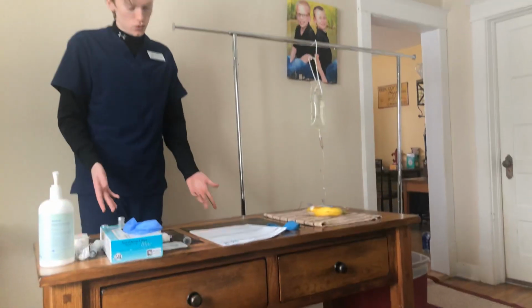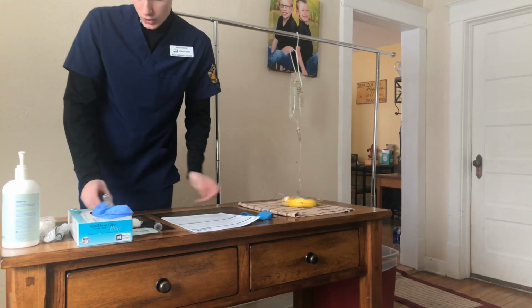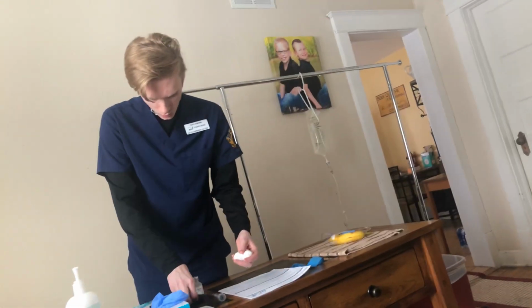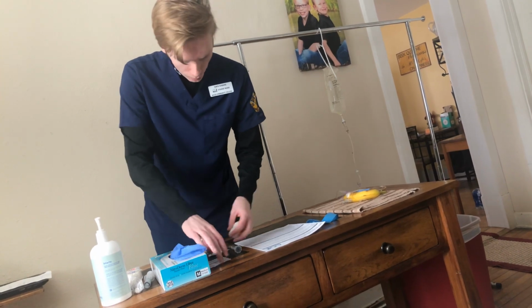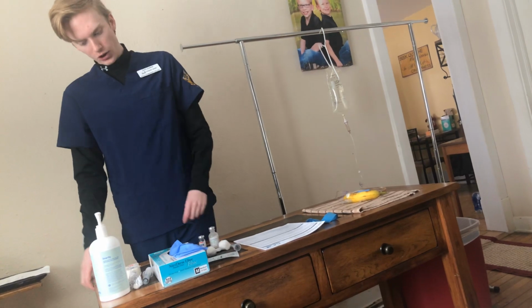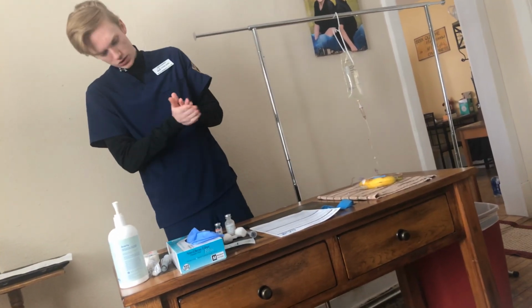I am going to head on over, get my equipment from the room, in which I have my vials, my needle, some alcohol prep pads, some cotton balls, some gauze, gloves, and some pocket hand sanitizer with me. I'm going to wash my hands before I enter the patient's room.